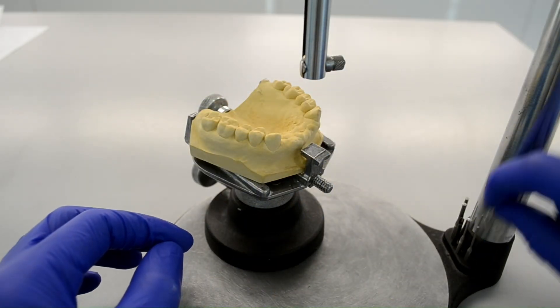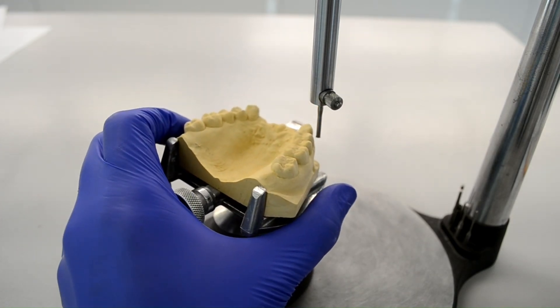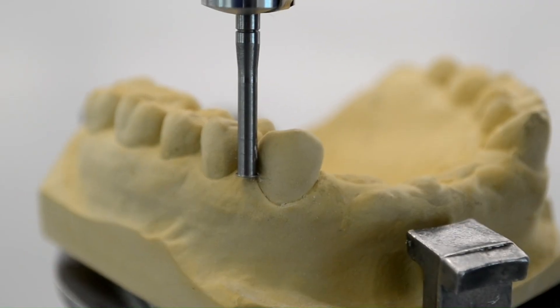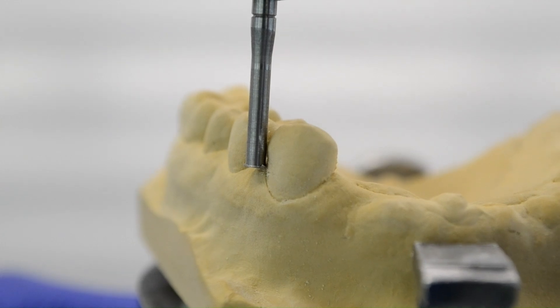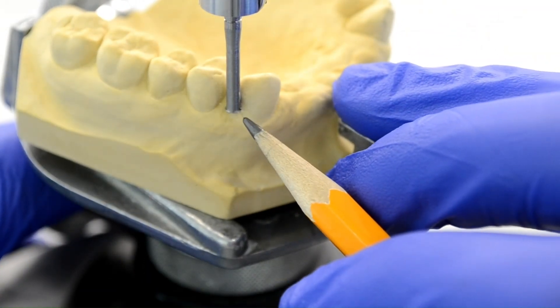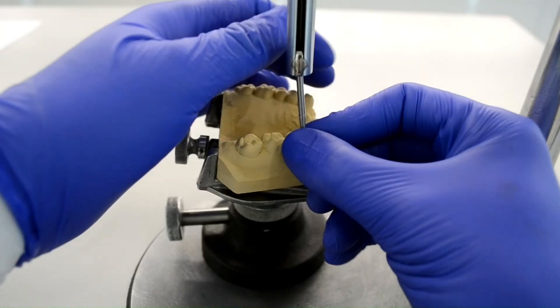Once we are satisfied with the path of draw, it's time to switch out the analyzing rod for the 0.01 inch undercut gauge. We will now attempt to find those undercuts that we decided we needed in our initial plan. In order to identify the location of an undercut, the undercut gauge needs to contact the tooth at the shank and the disc. The undercut is located at the point of contact of the disc with the tooth surface. To mark that undercut, the cast is pushed away slightly and a pencil mark is made at the contact point of the undercut gauge, marking the undercut location. This process is repeated for all other abutments.